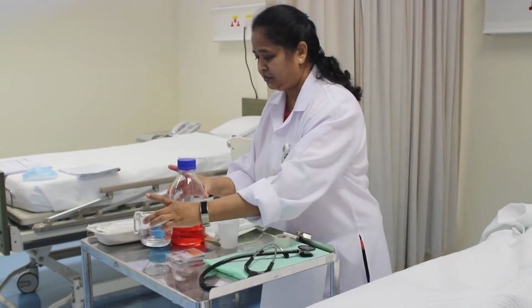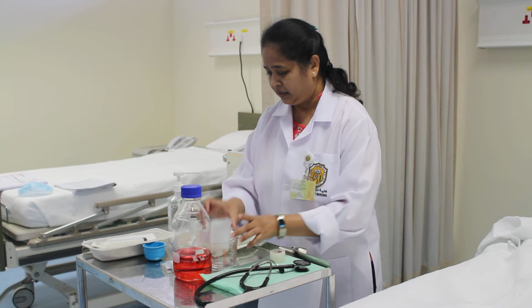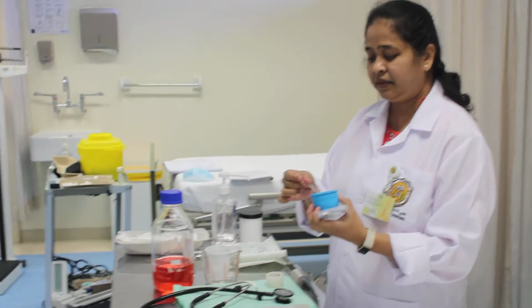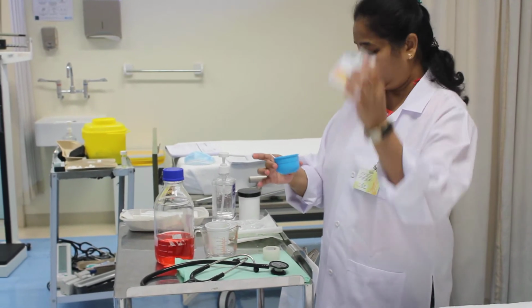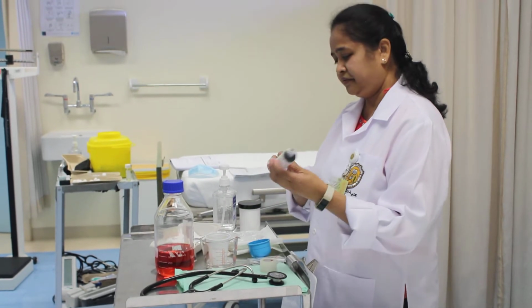If I am going to feed the patient continuously, let me prepare all the feeds. These are all the feeds which I need to prepare. I need to check his pH, the stomach contents pH. So I have taken a pH strip in a container, and to read it I have this checklist. And also I need to take the 50 ml syringe.